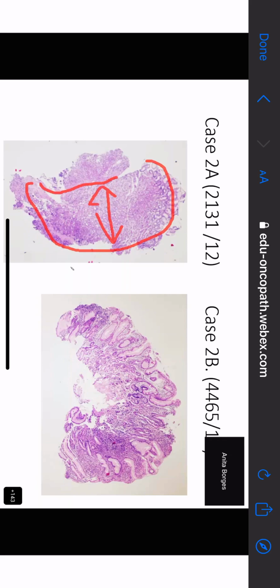This is crushed at the bottom over here, so we can't see anything, but otherwise this is absolutely normal. And there is something else that we can see perhaps over here, which we will have to see what that is, because that is deep to the muscularis mucosae. Shweta, can you see this? Yes, ma'am. I'm not so sure that you could see it.